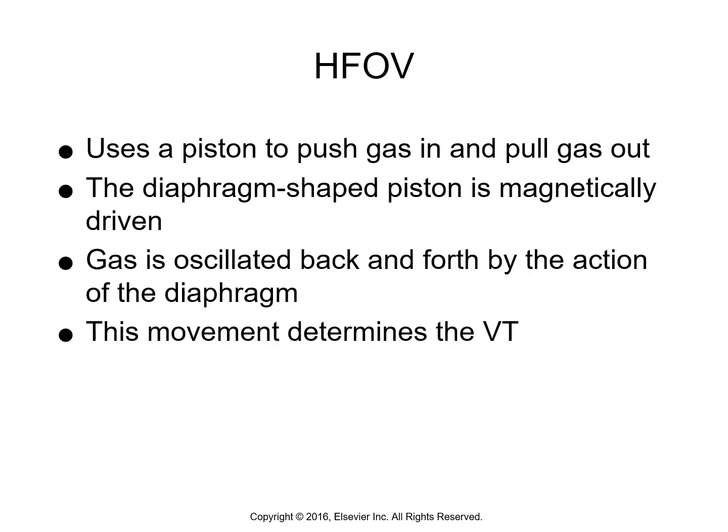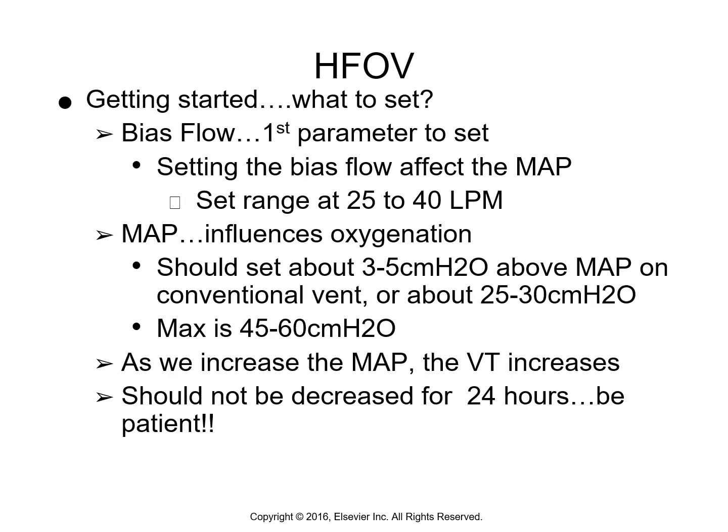All right. So, like I talked about before, it uses this piston to basically push and pull out gas. It's a diaphragm-shaped piston that's magnetically driven, and the gas then is oscillated back and forth by the action of the movement of the diaphragm, and that's what helps determine the tidal volume. Okay, so how do we look at where to start with these patients?